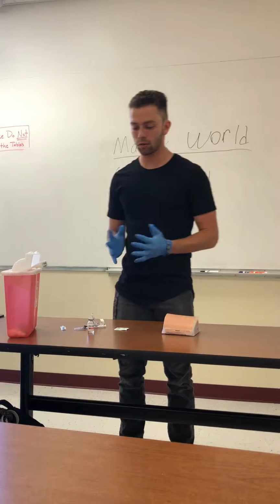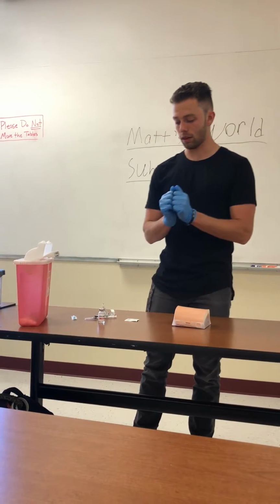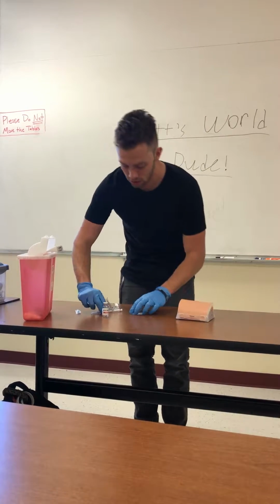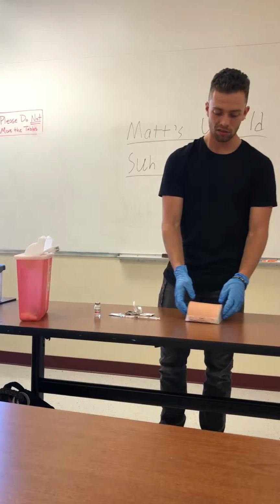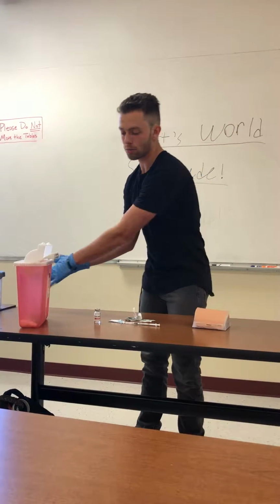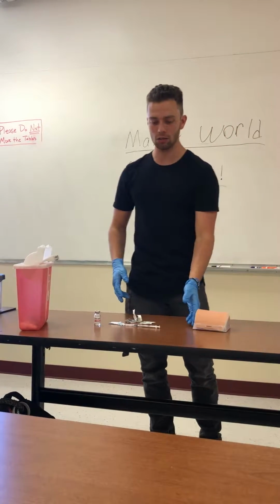Now, the next thing I will do is gather my supplies. So I'll gather my syringe, my alcohol pads, my needles, and my medication. And then I will have washed my hands and applied some gloves to draw out the medication with.